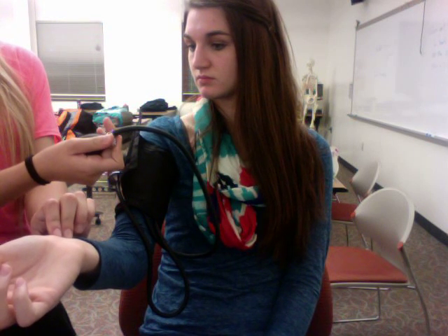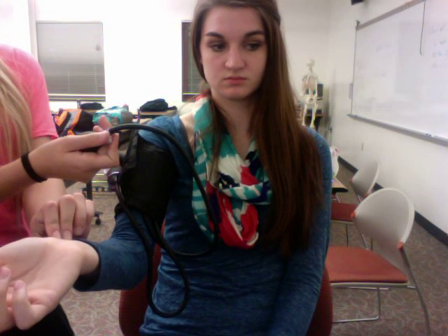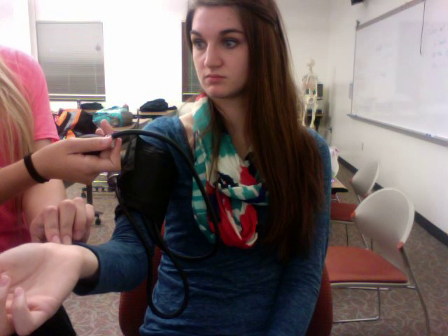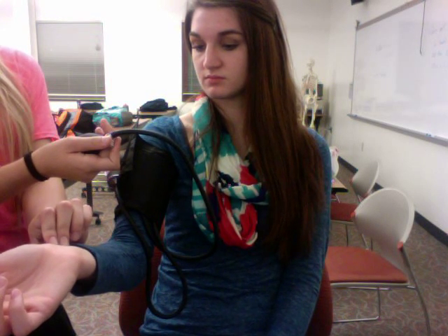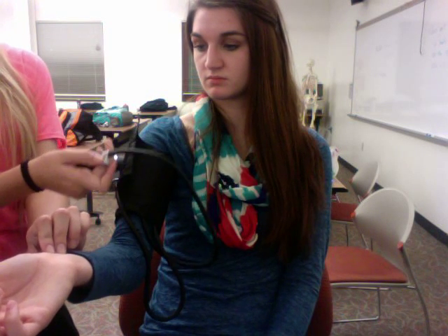On the gauge, you will watch for what number the gauge is on when you first feel the pulse. When you feel the pulse, that will be your systolic part of the blood pressure, which is the pressure created when the heart contracts and forces blood out and into the arteries. The normal systolic blood pressure for an adult is 120.